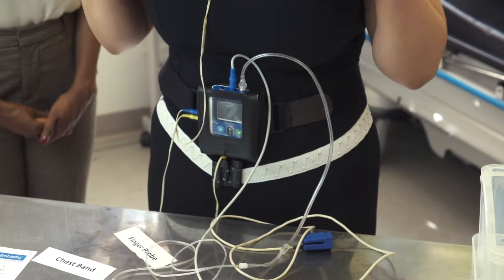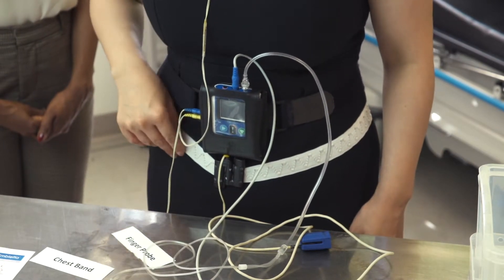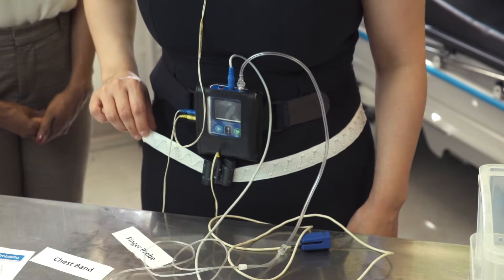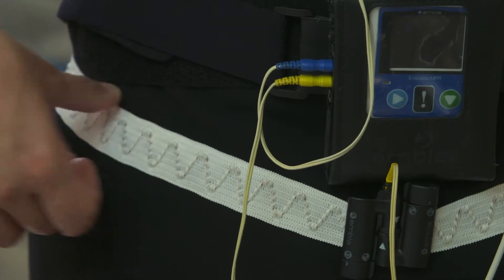As you breathe during the night these bands will stretch and they pick up your breathing pattern. There is however a wire running through them, so ideally you want to wear this over the top of your clothing to create a barrier between you and the device.